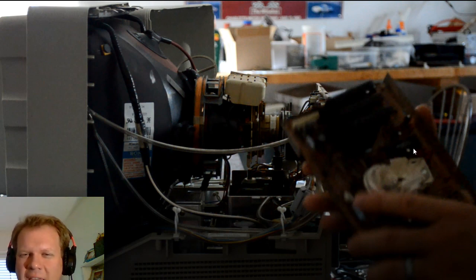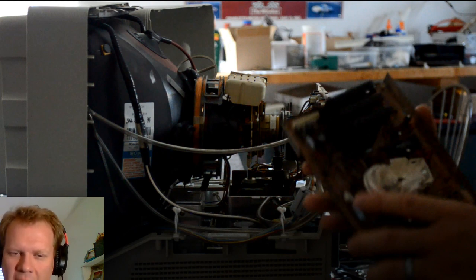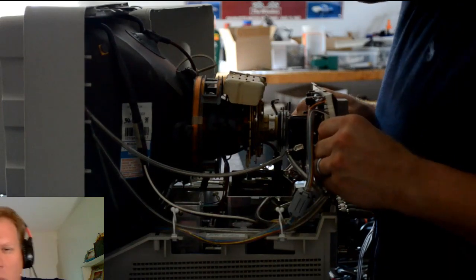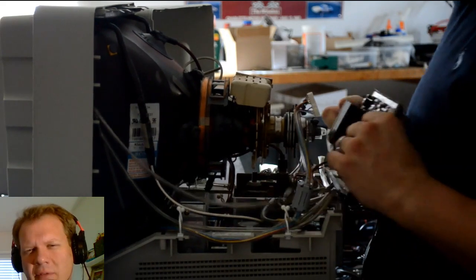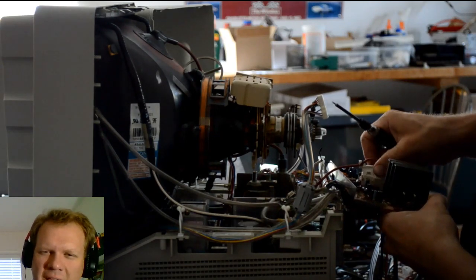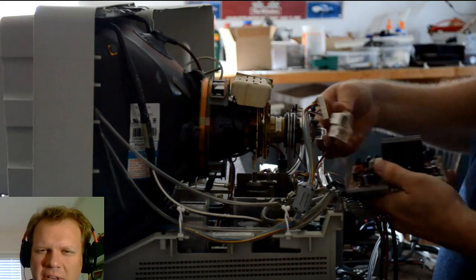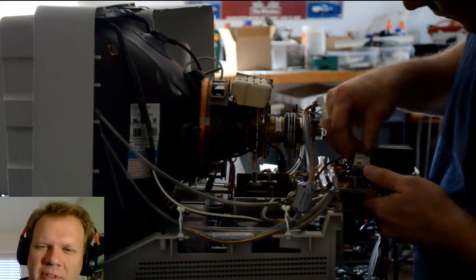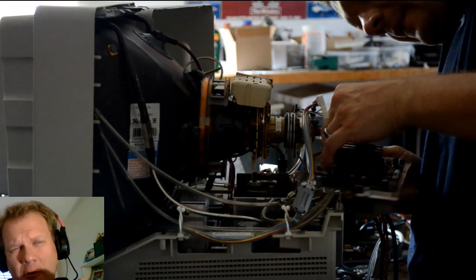So rather than rebuilding the board completely, since I had a second monitor that I was allowed to use for parts, I took that other board out of the other PGM, and I swapped those boards. The original board probably has a bad capacitor, or maybe some other type of IC had gone bad. But I was able to just get this out. Now, there is that little plastic piece around the neck where the back of the CRT, actually, the gun goes right into there. That's the only thing you need to pop out so you can pop in the new neck board.